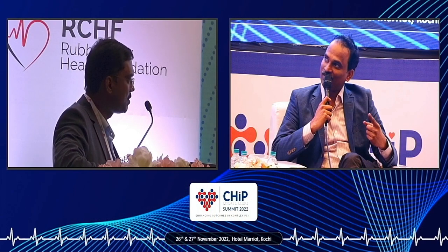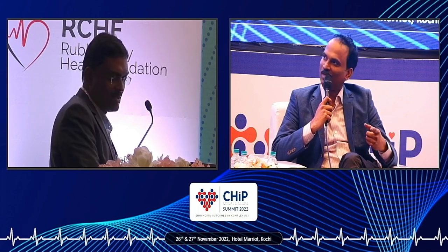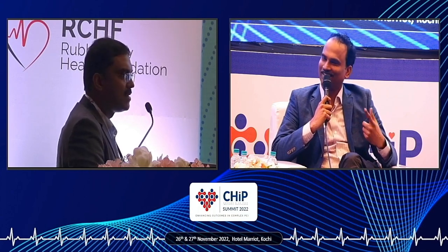Do you think we can slowly inch towards a kind of lifetime management of LMCA bifurcation with laser? You mean to say post LMCA PCI with restenosis? No, if the patient gets restenosis, do a laser and a drug-eluting balloon, again restenosis, do a laser and drug-eluting balloon.